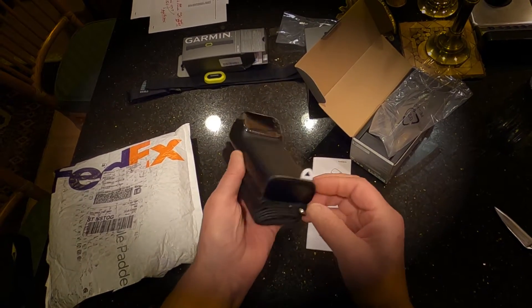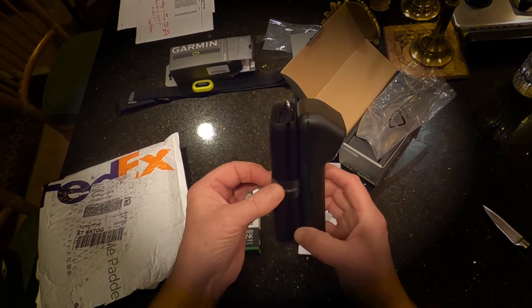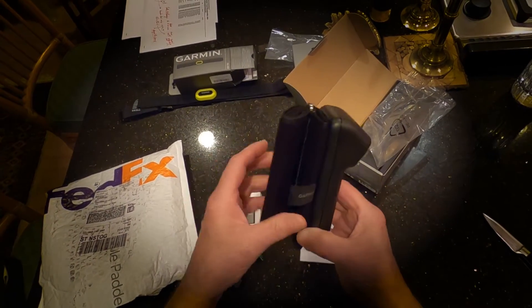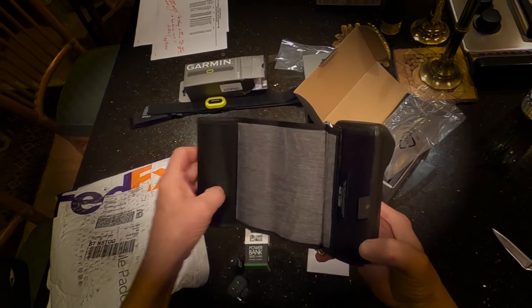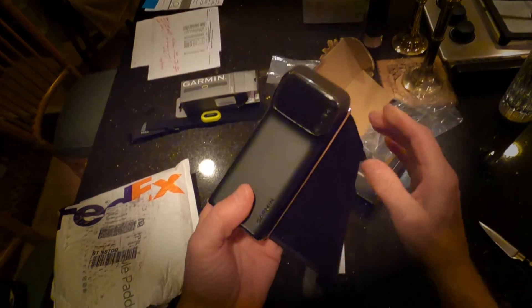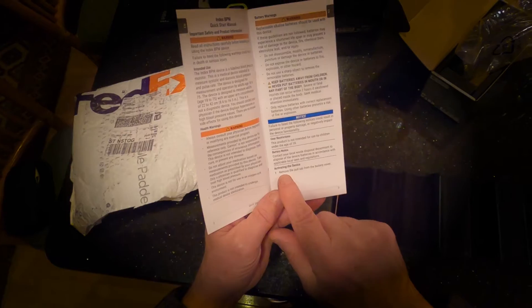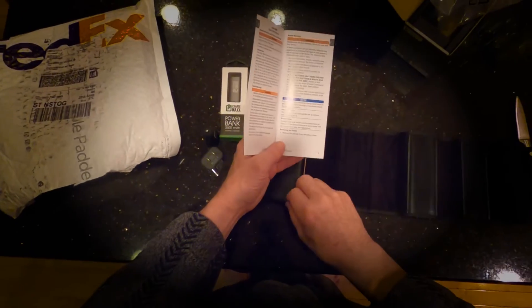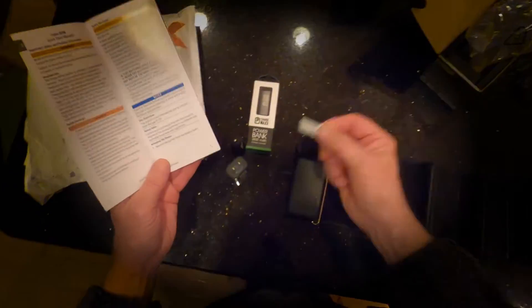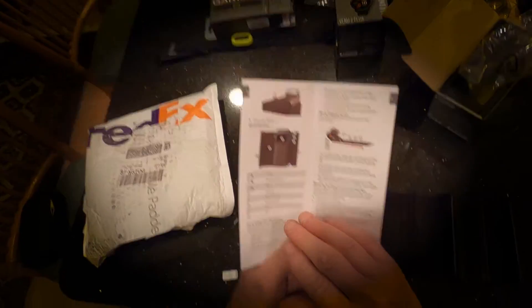I'm not going to take these covers off. I guess this — you pull this — is probably the battery. So I have another blood pressure cuff that I will compare this to. Here we go. Remove the pull tab from the battery cover. Press any button.